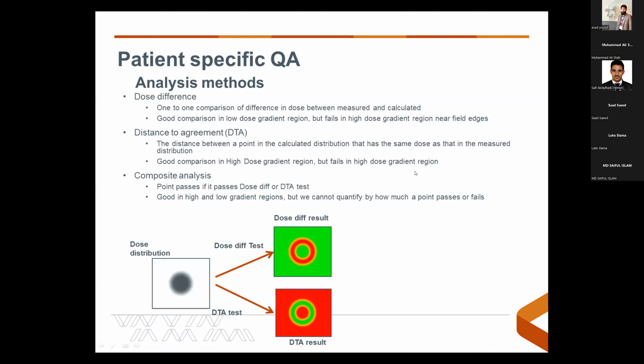Okay, thank you. And one more question: how does VMAT reduce the MU per gray compared to IMRT? This is a bit of a hard question to answer. I'm not actually sure of the answer to that, but I definitely do see it in our patients that we always have a lower MU for VMAT plans compared to IMRT for a similar dose.